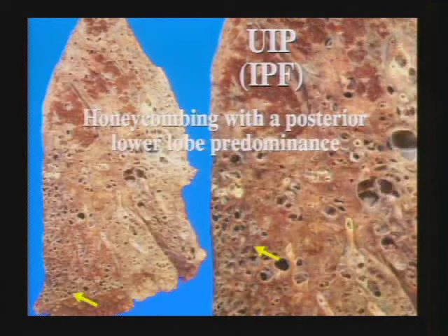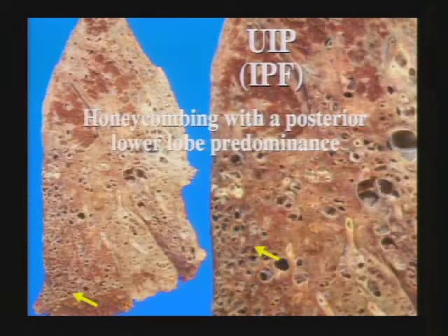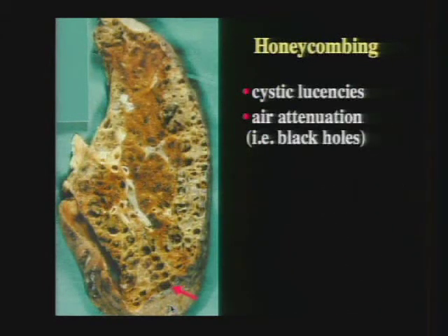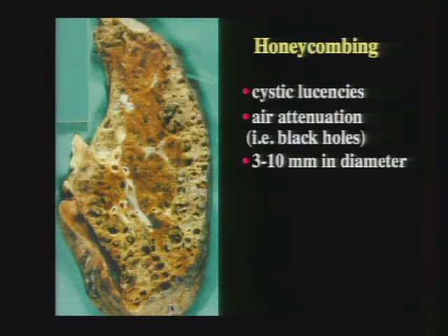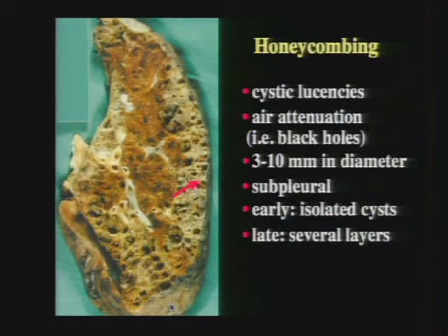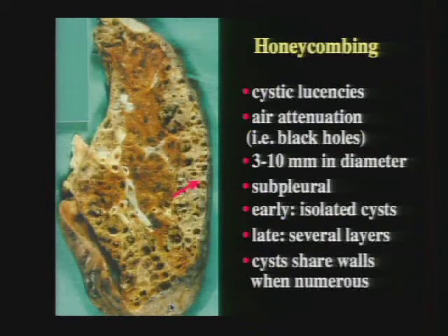This sagittal lung slice in a patient with UIP-IPF shows very nicely the typical posterior subpleural location of honeycombing, with the posterior costophrenic angle most severely involved. Here is the cross-sectional appearance of honeycombing: cystic lucencies, areas of lung destruction containing air seen as black holes on CT. They are typically three to ten millimeters in diameter and must be subpleural. Early on you see only one or two isolated subpleural cysts; later you see multiple layers of cysts beneath the pleural surface, sharing walls when numerous.